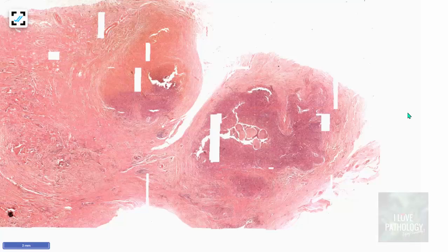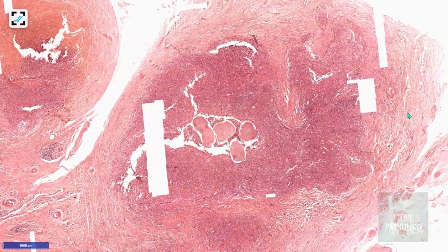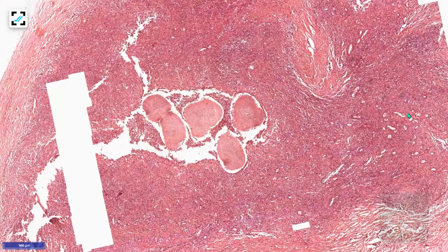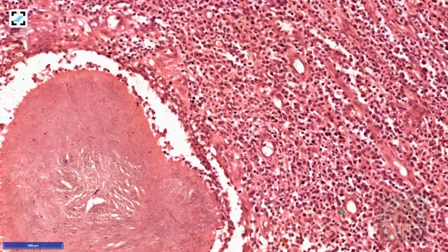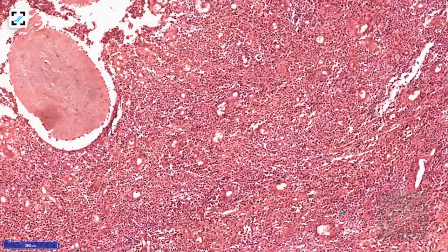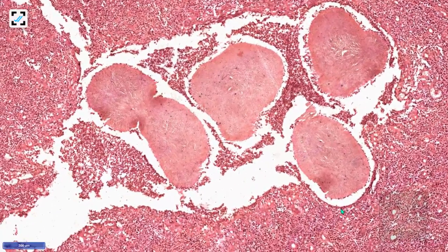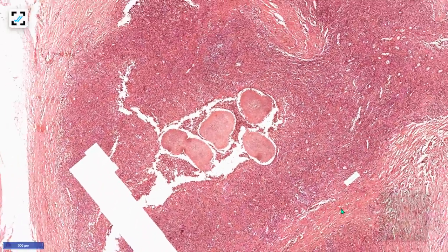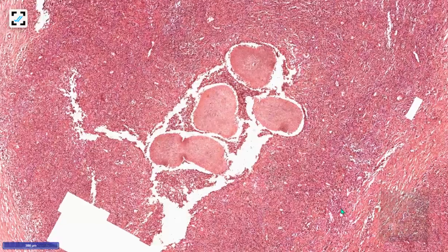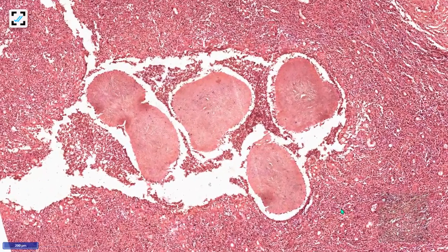Let me explain the microscopy of actinomycosis once again using this virtual slide. This is a biopsy taken from actinomycotic discharging sinuses. These are the sulphur granules which were grossly evident — conglomerations of gram-positive filamentous bacteria. Note the inflammatory cells surrounding the bacteria: dense neutrophilic and lymphocytic infiltrate. This is how microscopy of actinomycosis looks. Identify the sulphur granules as masses of bacteria in the center of suppurative inflammation, which means dense neutrophilic infiltration, with lymphohistiocytic infiltration surrounding the suppurative inflammatory foci.